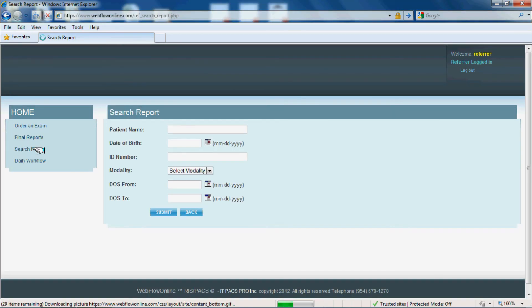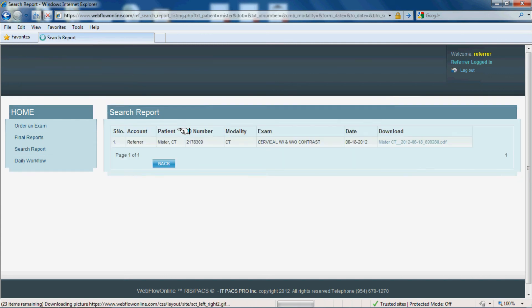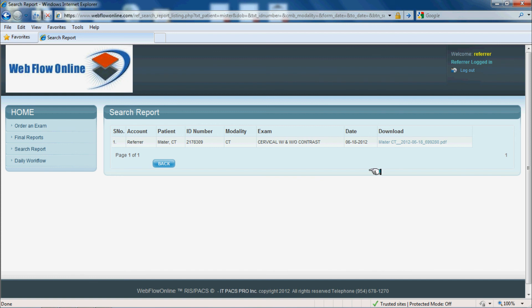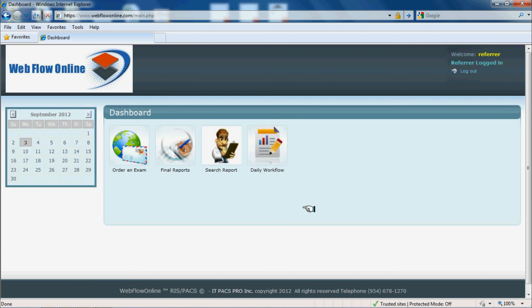Referring physicians also have the ability to search. They click search reports and can search by patient name or date of service. This concludes the front-end access for your referring physician.